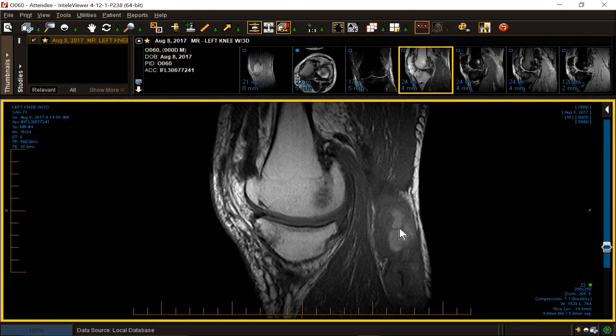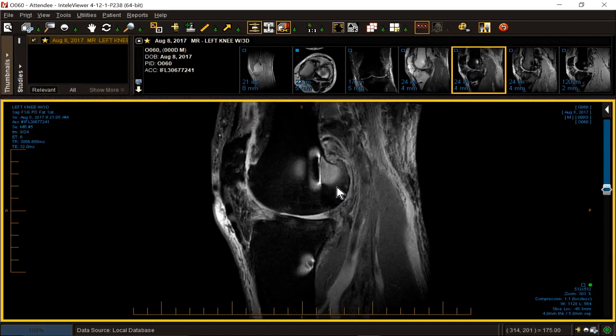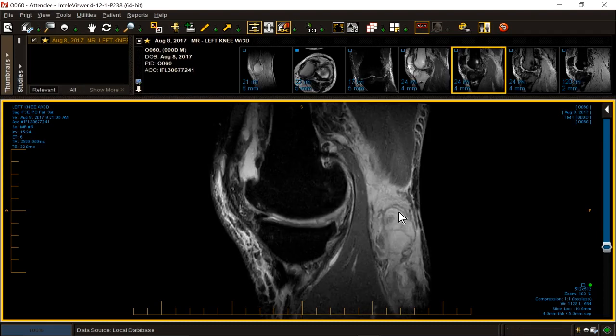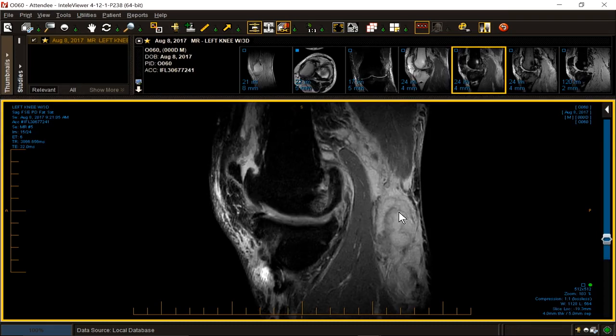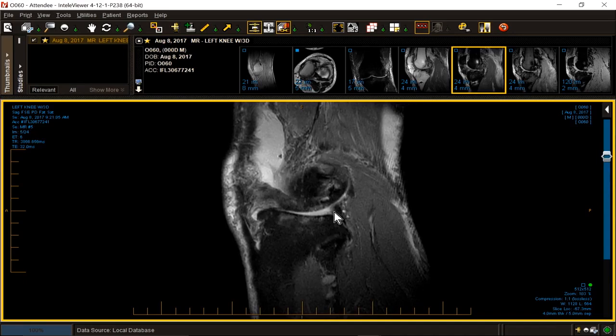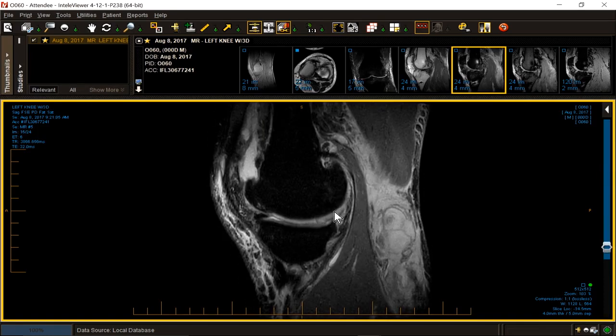They took him back to the hospital before I got the phone call to give him more Eliquis. Fortunately, I got a phone call, and we detoured him into the MRI and figured out very quickly that he never had DVT. He had a ruptured, bursting, bleeding Baker's cyst and an attritional, small popliteal venous system from prior bouts of insult. Nothing new in that category, and the MR solved the case in its entirety. He also has hideous DJD, a ruptured, bleeding Baker's cyst. These are very hard to control. We had to get him off Eliquis very quickly. Otherwise, he could have developed a compartment syndrome, and he was on his way.